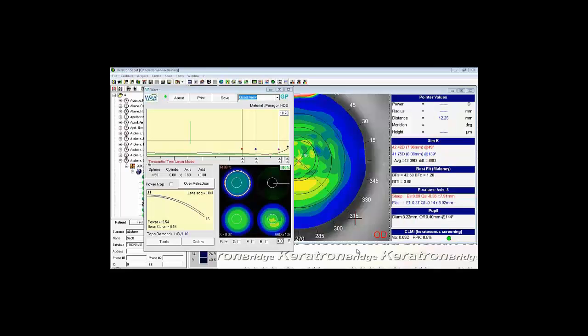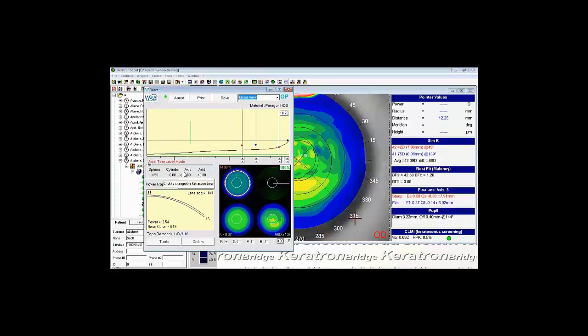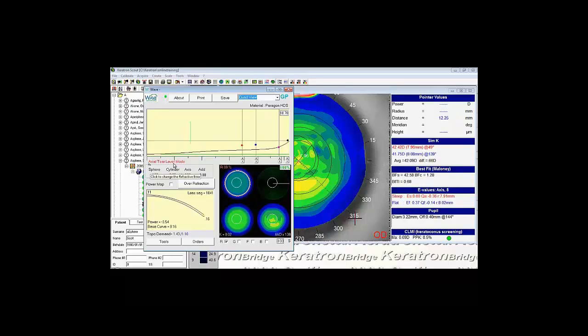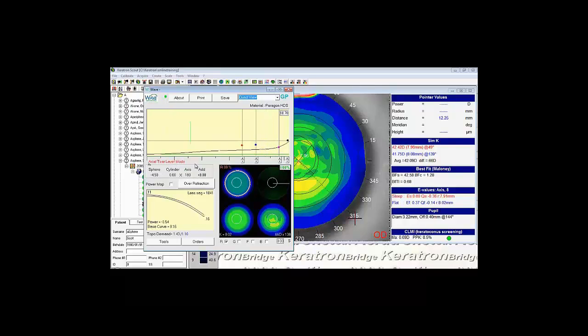The next design decision you'll want to make is whether you're going to use tangential tier layer mode or axial tier layer mode. As mentioned earlier, tangential will fit the lens just a little bit flatter and a little bit looser. Axial will design them just a little bit steeper and a little bit tighter. Since comfort is dictated by the edge, I tend to design most of my lenses in axial tier layer mode.